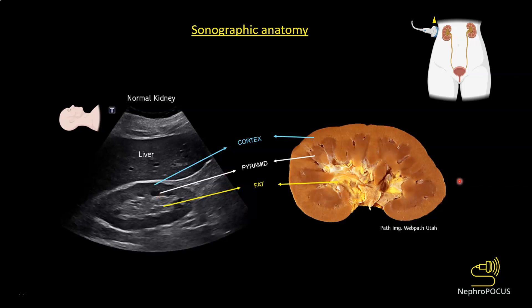The collecting system of the kidney is embedded in sinus fat. In a normal state, an undilated collecting system should not be visible. All you would see is a bright area in the middle of the kidney, which is sinus fat. The collecting system is visible only when it is dilated.